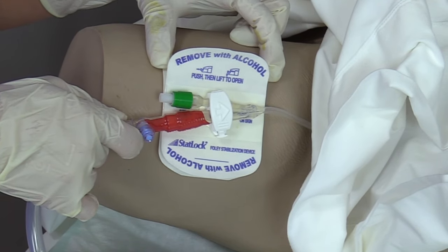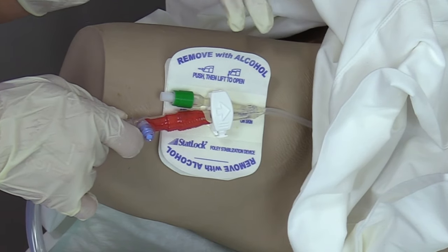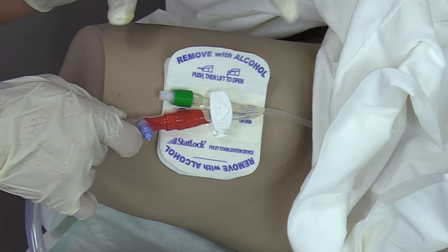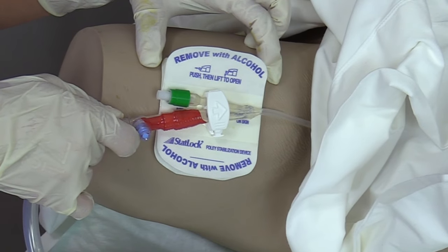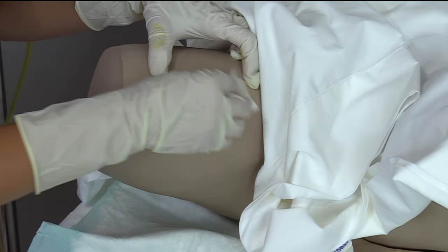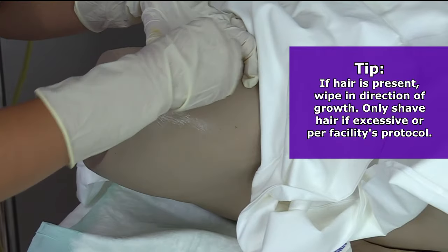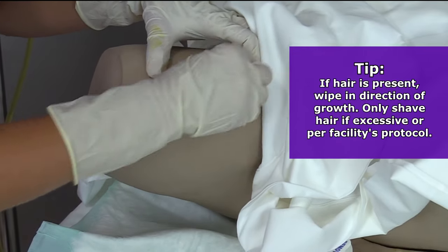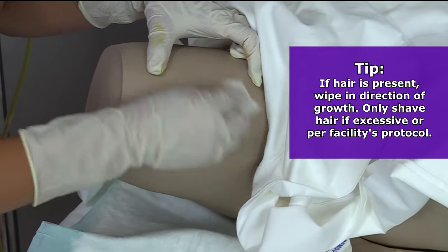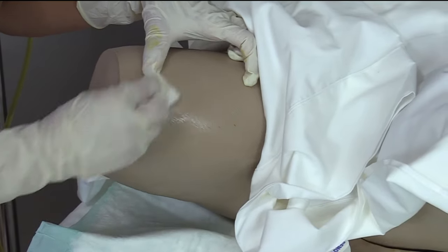Keep note of this area because this is where you're going to clean. We're going to clean this whole area with alcohol prep and then with skin prep. I'm putting my fingers here just to remind me of the spot. I'm taking my alcohol prep and cleaning an area even bigger than the STATLOK device to remove any dirt and grime on the skin. Then we're going to let that dry completely.